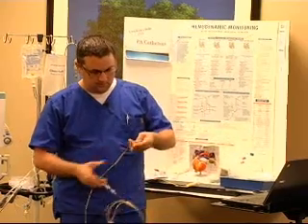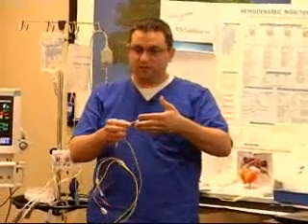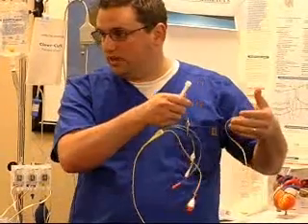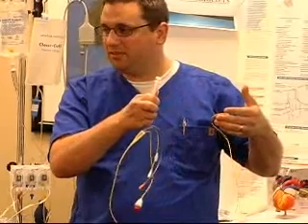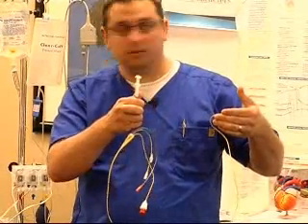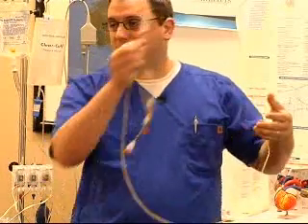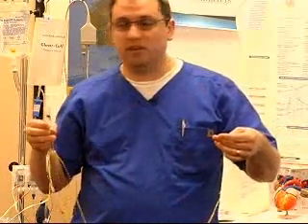As it's progressively going through, you're going to wait for it to get wedged in that position. Once you get into the wedge position, you're going to see your wedge waveform, which kind of resembles a CVP tracing, really. They're going to ask you to deflate the balloon, and you would hope for it to go back to PA. That would be ideal.